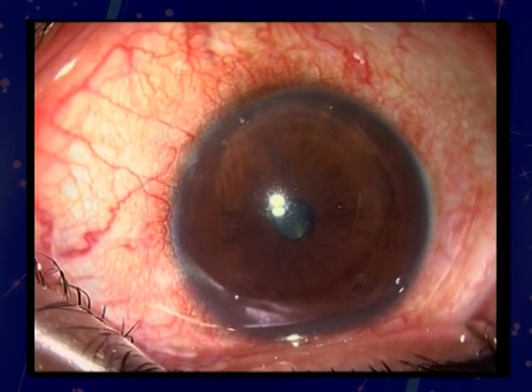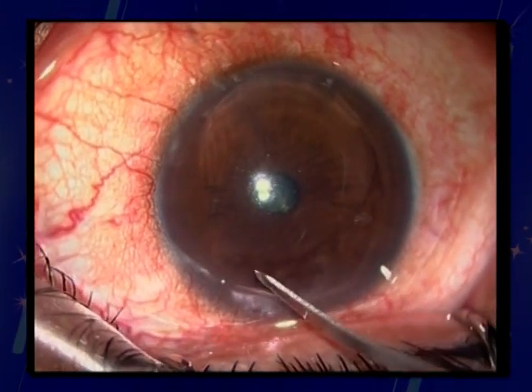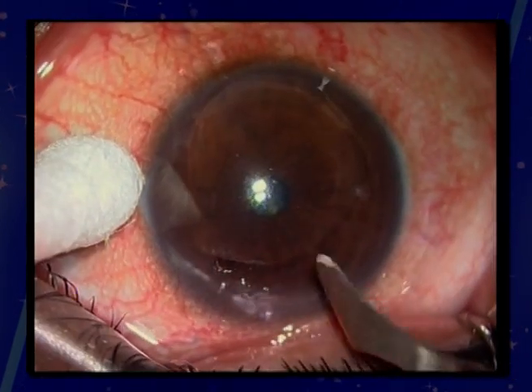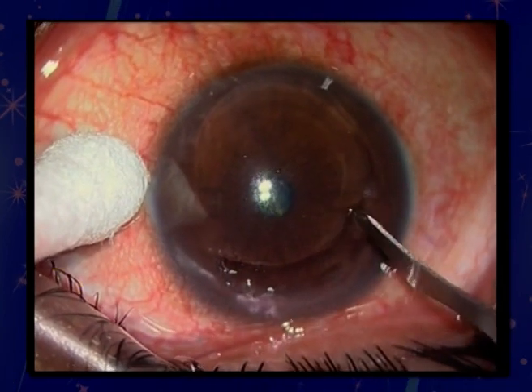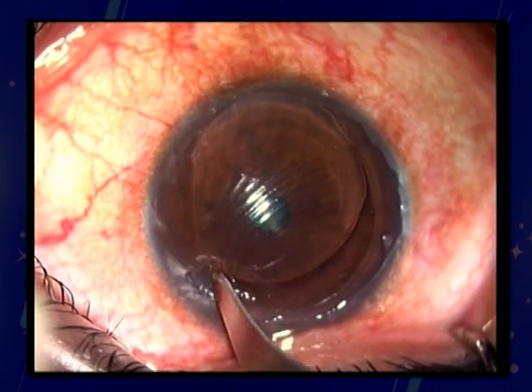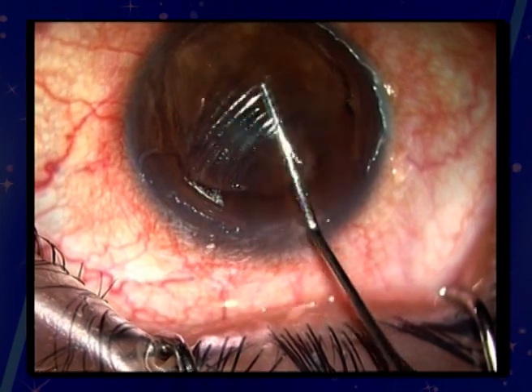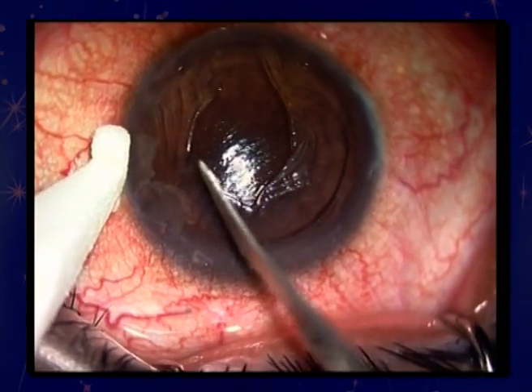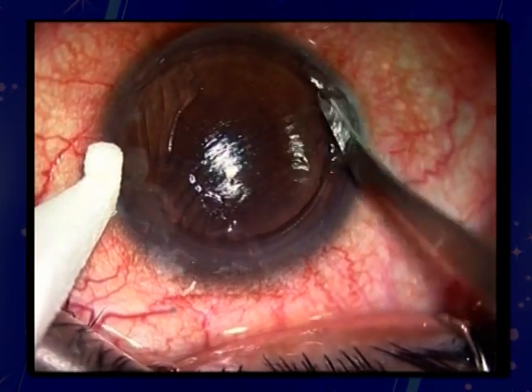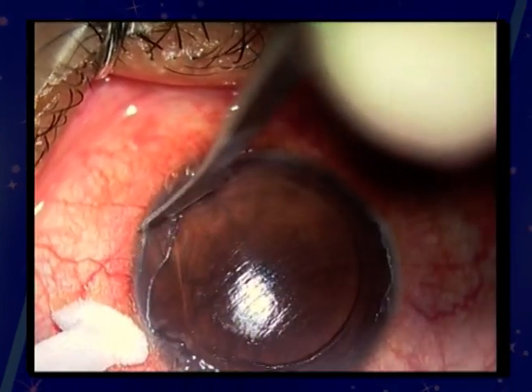The second case presented on the third post-op day with flap slippage and flap folds. Here, the stromal bed is exposed with epithelial ingrowth. In this situation, the epithelium over the exposed bed is meticulously removed with a hockey stick knife before lifting the flap. The flap is lifted. The folds in the flap can be best addressed only by removal of epithelium on the surface. So the epithelium is completely removed on the flap surface as well.